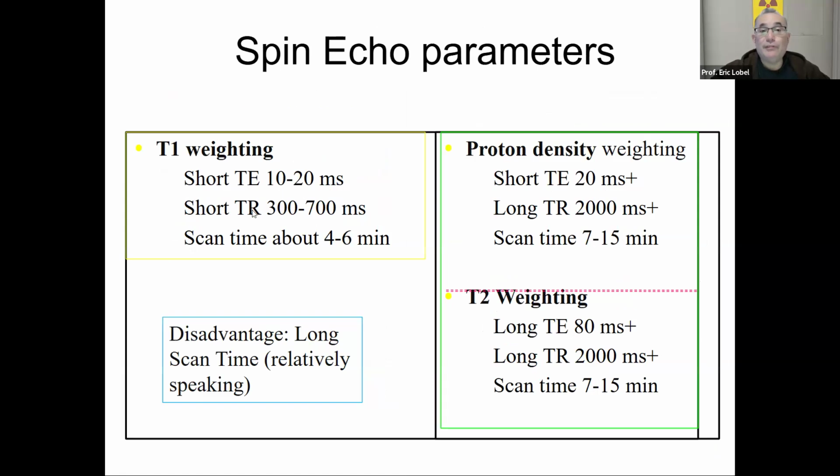That's basically because the TR is much less. If you think about it, right, 700 goes into 2000 3 times, right? So 6 times 3 is 18, and this is 15. It's in the ballpark, right? Kind of proportional to each other, basically.